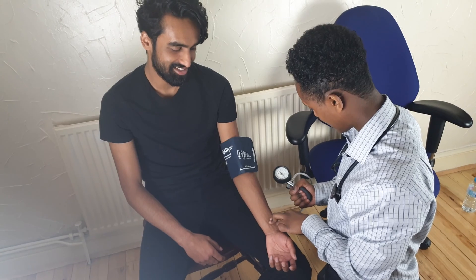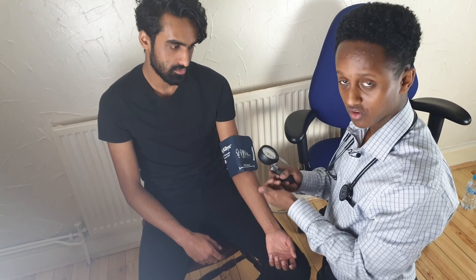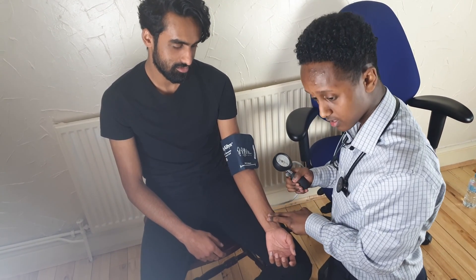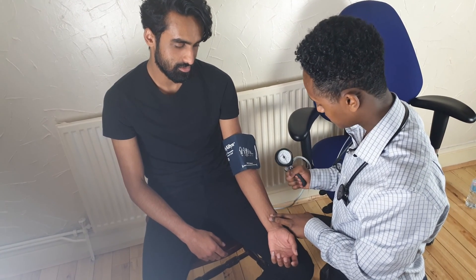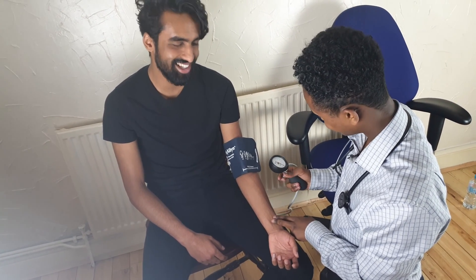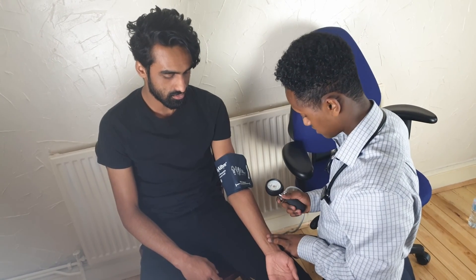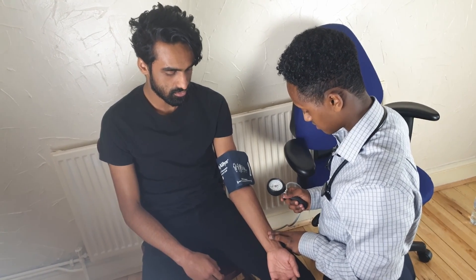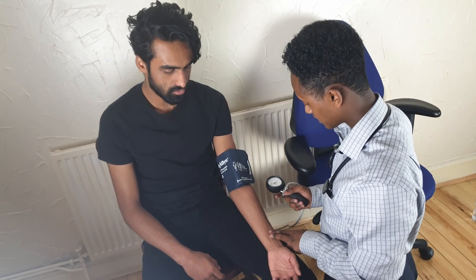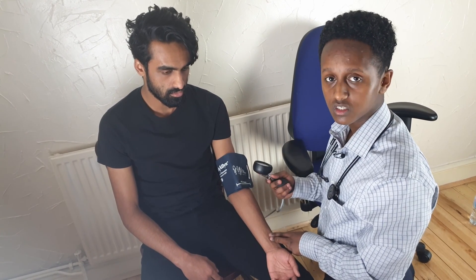So put two fingers there — you've got a good pulse. Make sure you turn the notch, because if you don't turn the notch the pressure isn't going to come through. Turn the notch, put two fingers there for the pulse, and inflate until you don't feel the pulse anymore. I stopped feeling it around 120–130, so that's a good healthy indicator that his systolic value is around 120, which is the NHS recommendation.